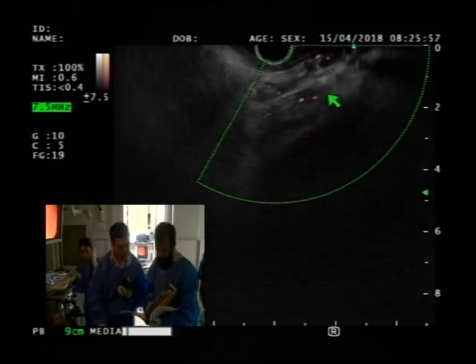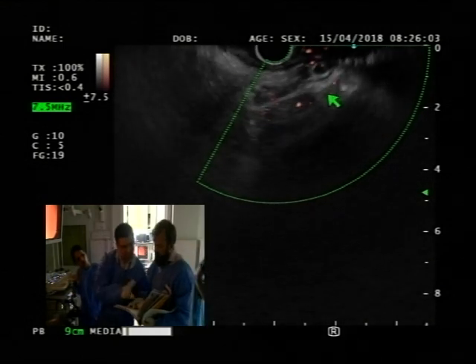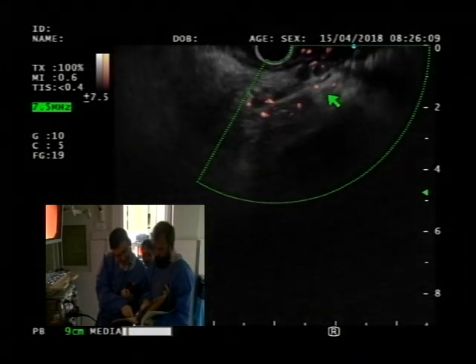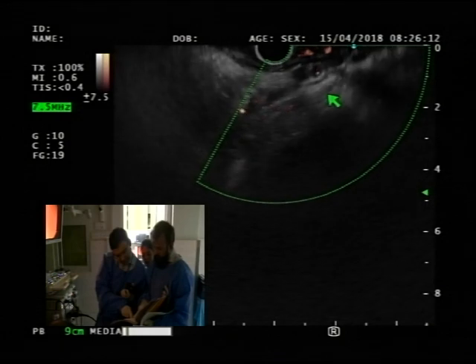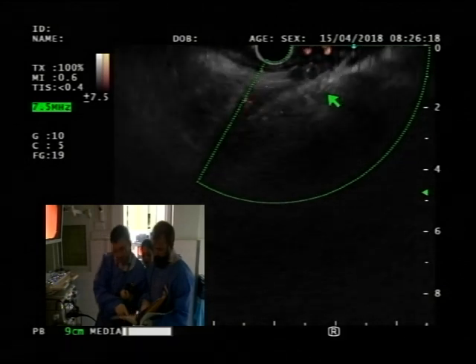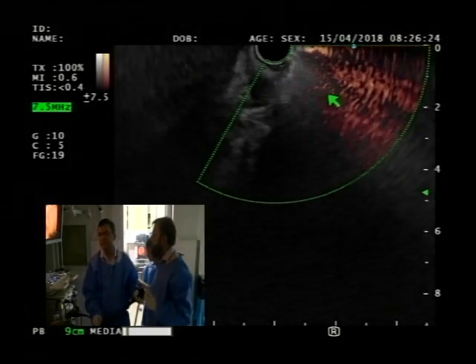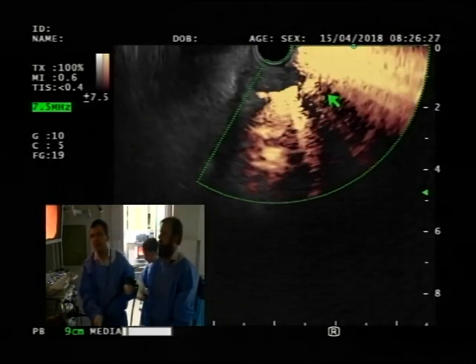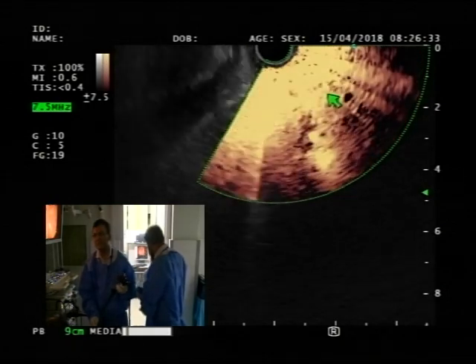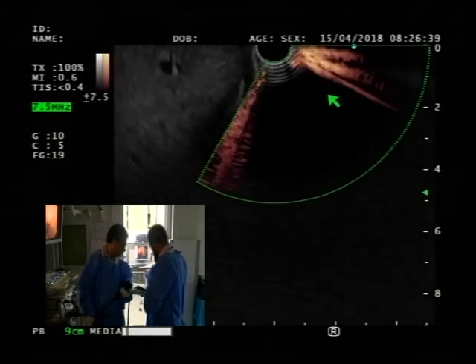They describe the mass as a hypodense, exophytic, heterogeneous nodular mass lesion at the level of the distal body. I don't care what they describe. We have seen it. It demonstrates internal septations abutting the splenic vein anteriorly, which is also between the greater curvature. Where was this CT scan done and reported, please? ARC. And who's signed it? Rashid Ahmed.